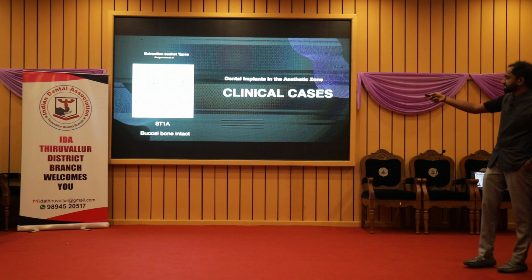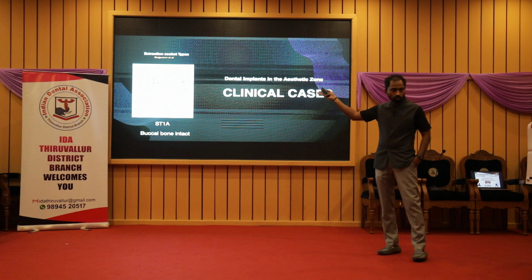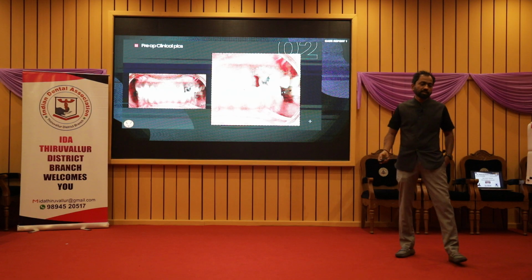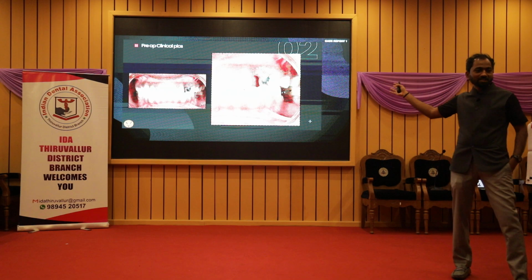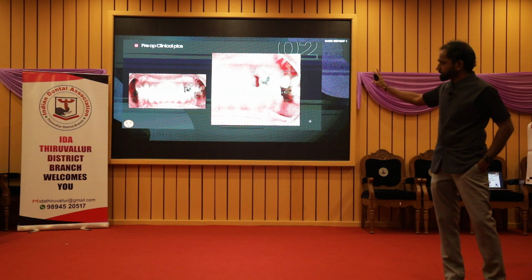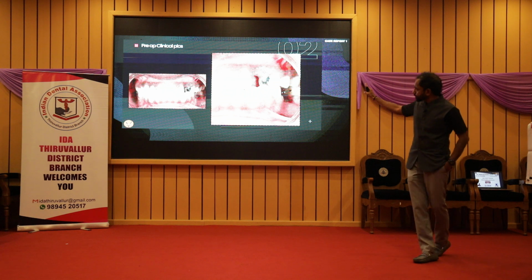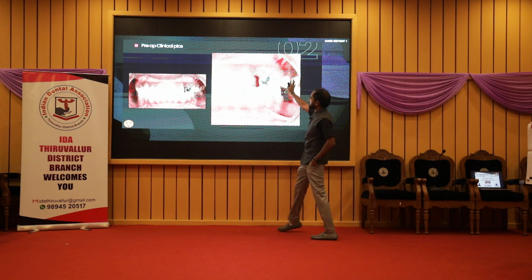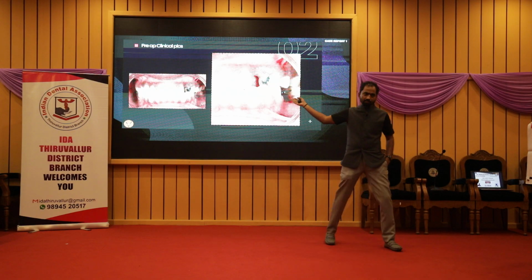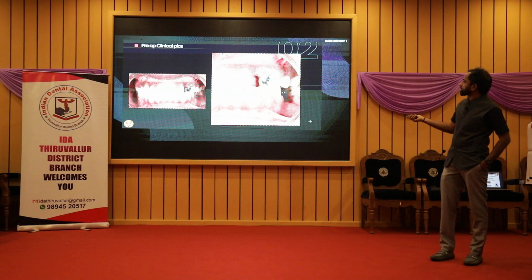Extraction socket type case is an ST1 type of case where you have a good amount of bone on the buccal side. Yeah, this is a last minute presentation, so I don't know what slides are coming. This is a straightforward case. This is a very straightforward case. Bone is there. A little bit of tissue has gone up. That's all. You didn't even lose that much papilla. You can even regenerate the papilla. So that is an aesthetic zone. So I just put it there.